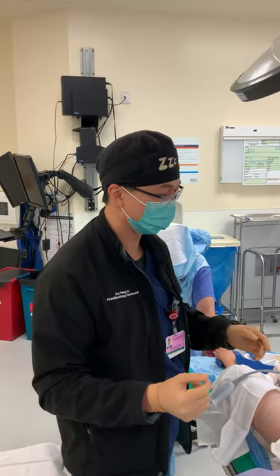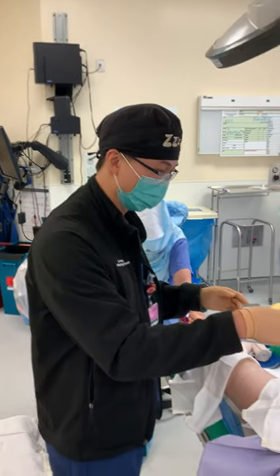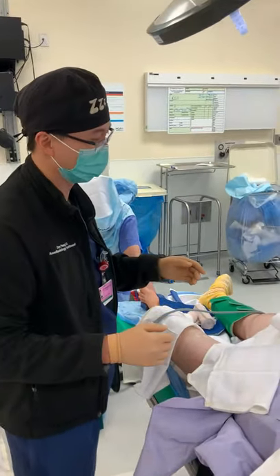Hi, this is Dr. Peng from Metro Anesthesia here in Dallas, Texas. I'm here to demonstrate how to use this catheter system made by Kiong.